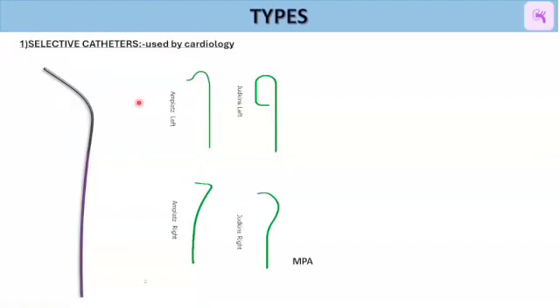We will try to classify the catheters as we go on. So this is the straight configuration. All these three, Bernstein, this is the longer Bernstein. These are curved catheters. And this is angled, sorry. This is straight, these are angled, and this is hooked. Straight, angled, hooked catheters. These are the catheters which I saw in cardiology.